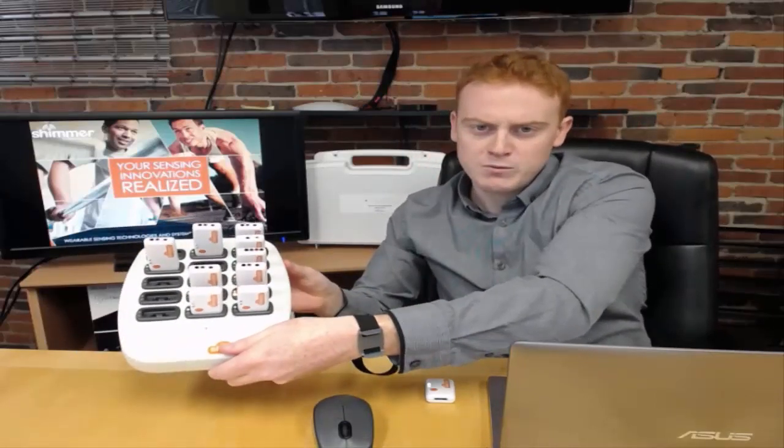The next fundamental piece of hardware to mention is the dock or base. For today's example, you can see our Consensys Base 15, which enables the multi-sensor management of up to 15 Shimmer units simultaneously. We also have a smaller Base 6 and a single dock that provides similar functionality when working with smaller quantities of sensors. The base connects directly to your PC or laptop via USB port.